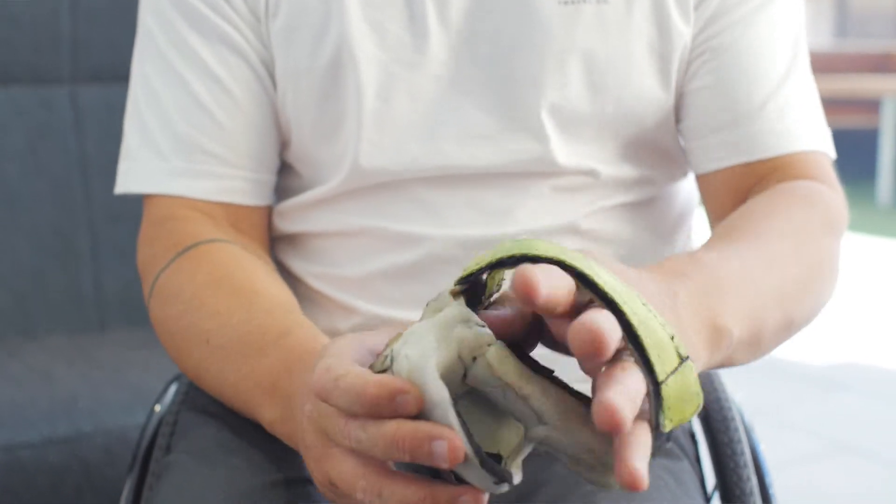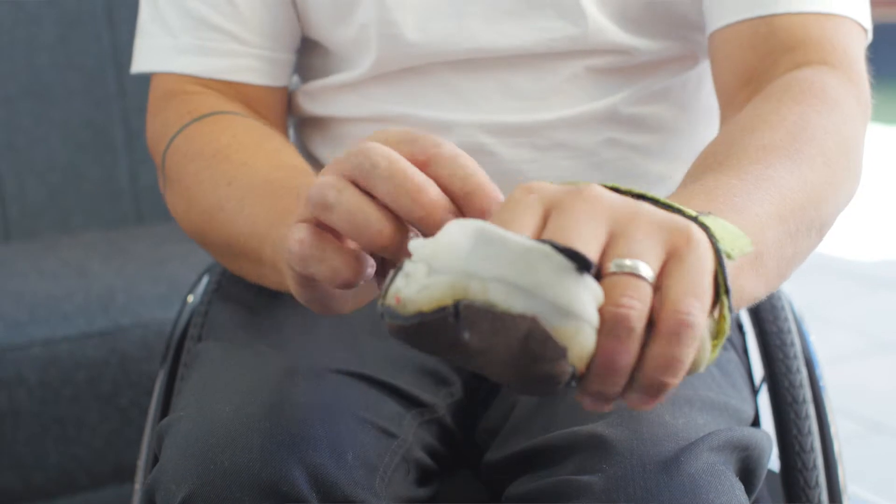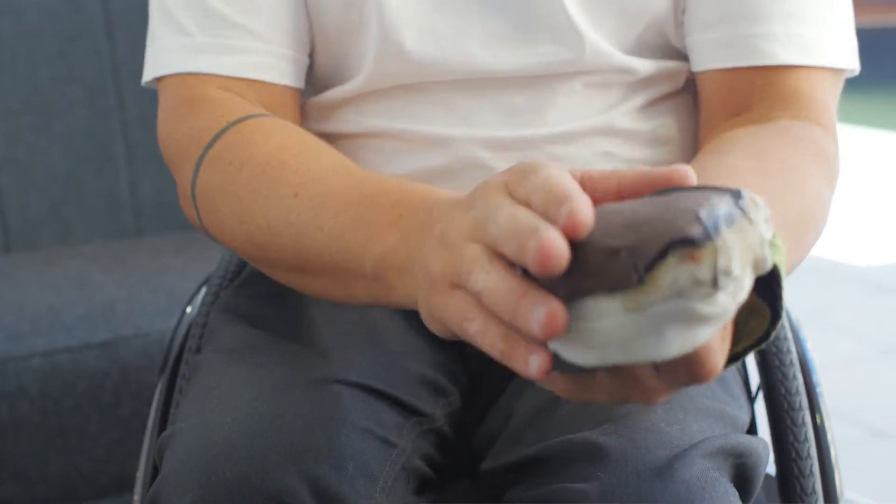I made these myself — it's just a plastic mold to my hand. But this one is actually different to the right one; you can see one's smaller, one's bigger. Ideally what I wanted is something custom to my hand that's light, that's strong, and where left and right would be the same.